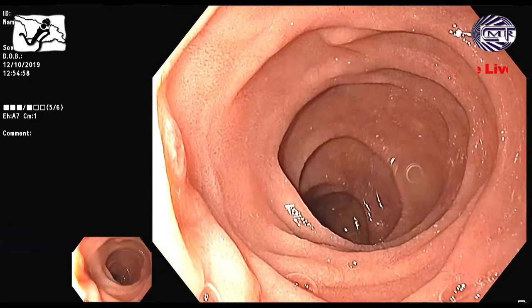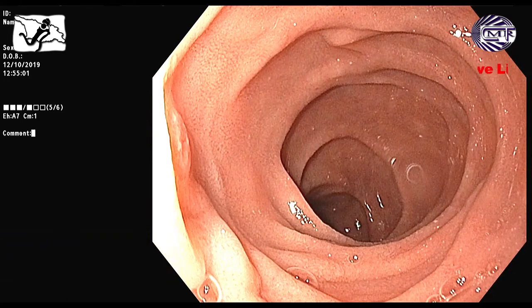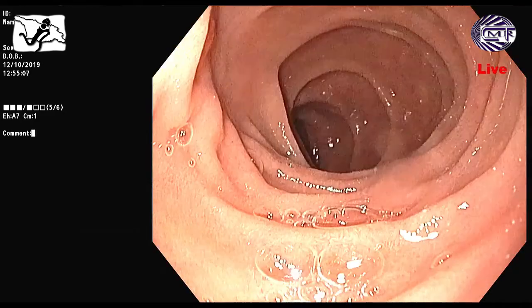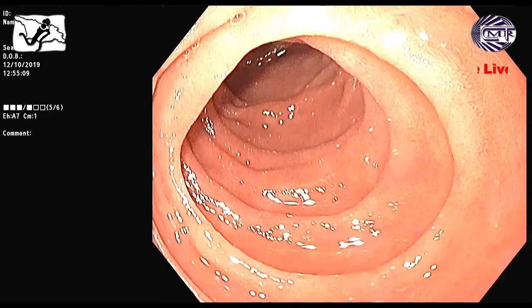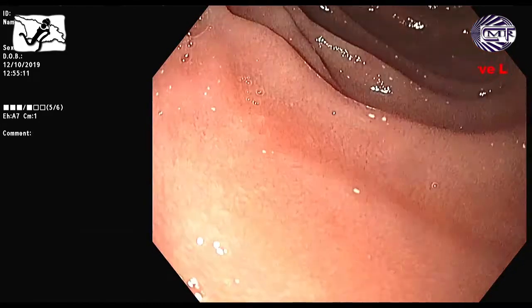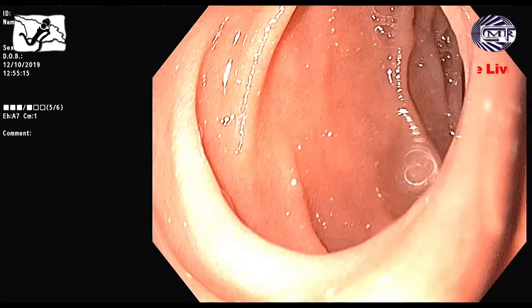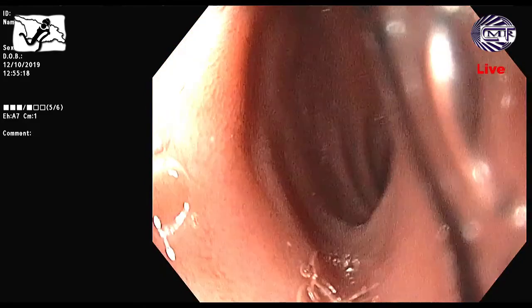This is the ampulla, right? The 9 o'clock way, we can see the ampulla, right? The small shape, right? And then the papilla. A little bit pull back. Okay. And translate in. Yeah. And this is SD.